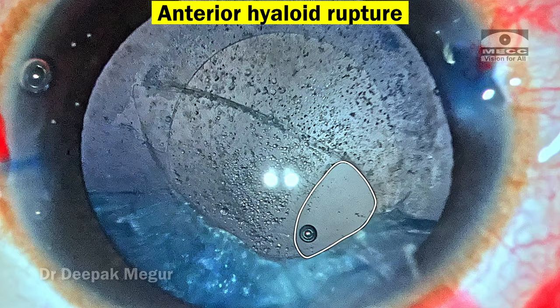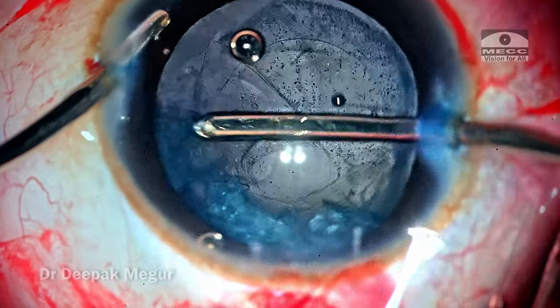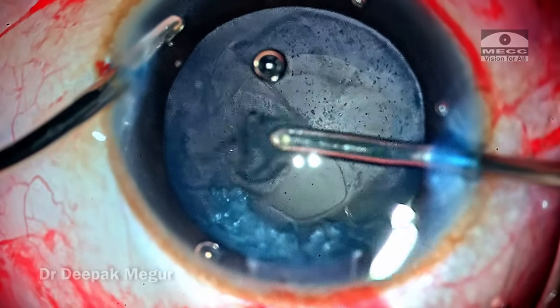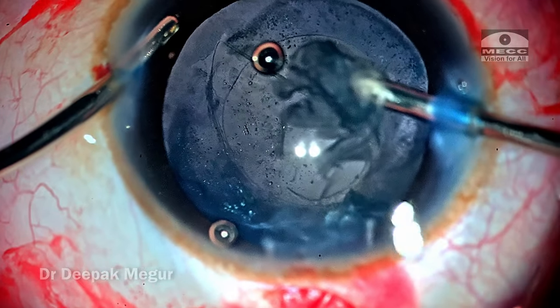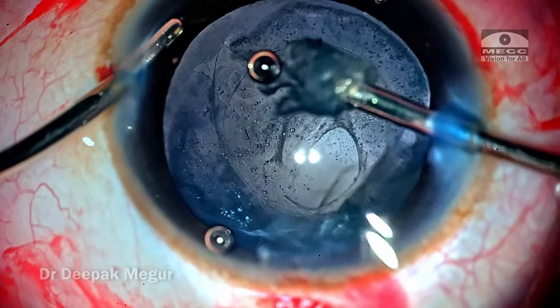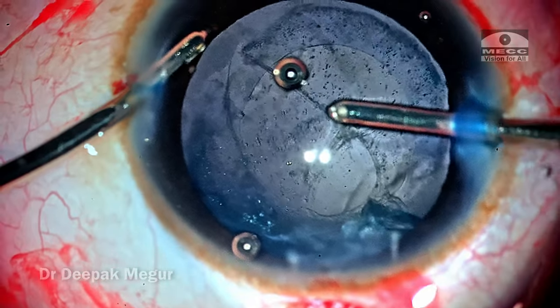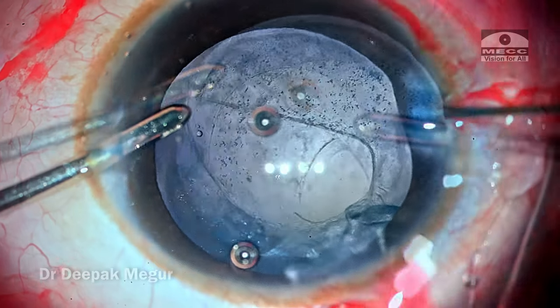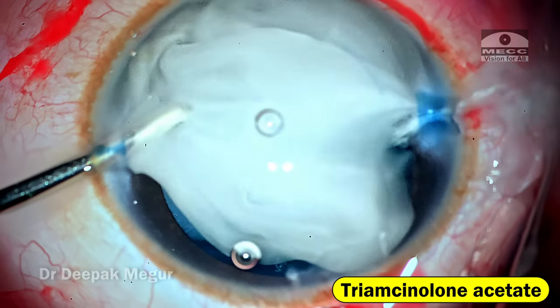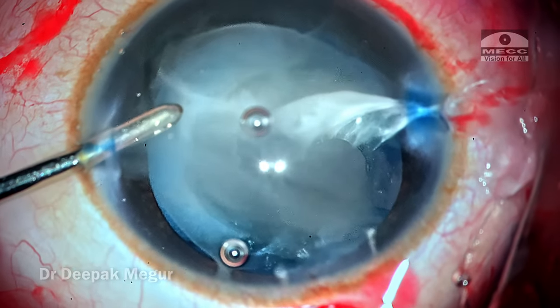The anterior hyaloid seems to be a little bit thickened and there is a lot of inflammatory debris under the anterior hyaloid face. I want to remove the remaining cortex before beginning vitrectomy, hoping the vitreous has not yet prolapsed into the anterior chamber. As this last bit of cortex is aspirated out, I can feel that the vitreous is already in the anterior chamber, so I am going to use triamcinolone acetonide to stain the vitreous.